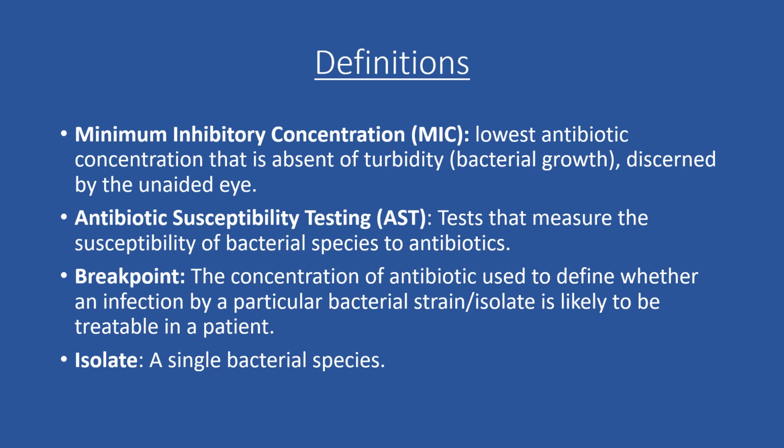Each system uses a standardized inoculum and introduces it to varying concentrations of antibiotics. The interpretations of the relationship between the bacteria and antibiotics are dependent upon which set of guidelines the user is intending to use, which is dependent on its use. So if we're using it in research or if we're using it in industry. Or region, so the United States versus the United Kingdom, and each uses their own separate interpretation of MIC results.